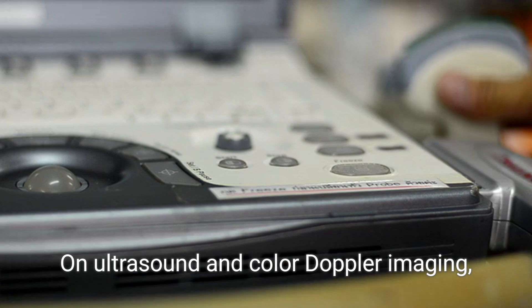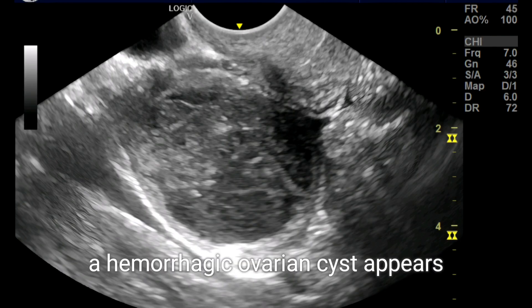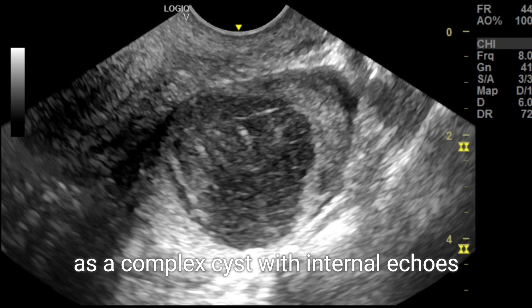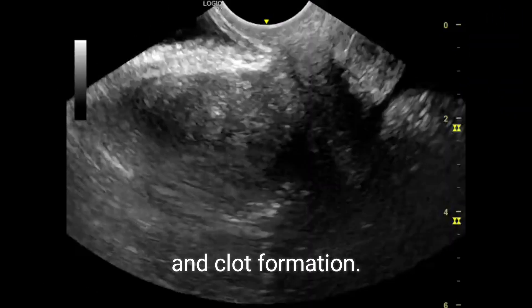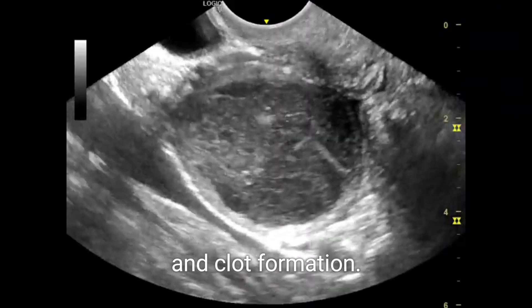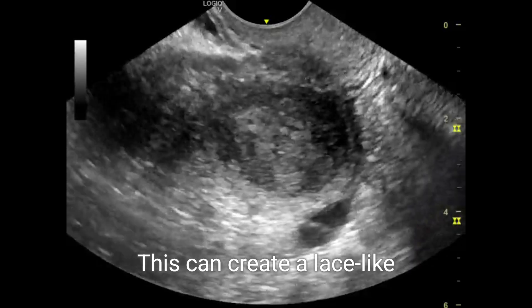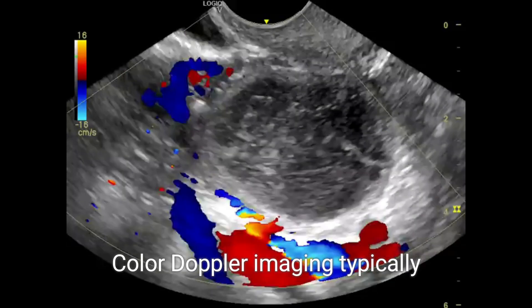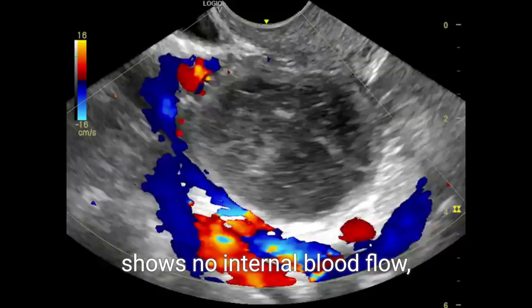On ultrasound and color Doppler imaging, a hemorrhagic ovarian cyst appears as a complex cyst with internal echoes or septations caused by blood and clot formation. This can create a lace-like pattern within the cyst. Color Doppler imaging typically shows no internal blood flow.